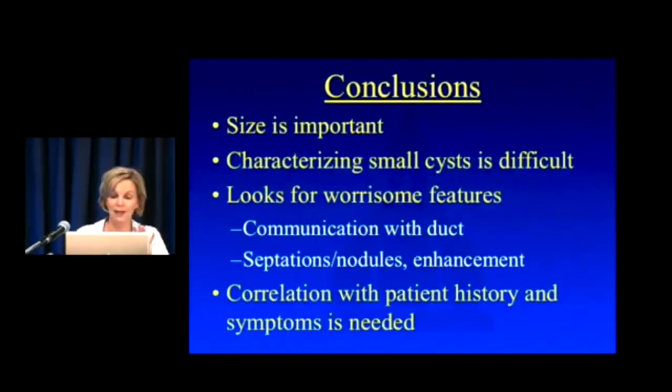So in conclusion, size is important. The size of the cyst may help you decide whether or not you're going to resect it or not.